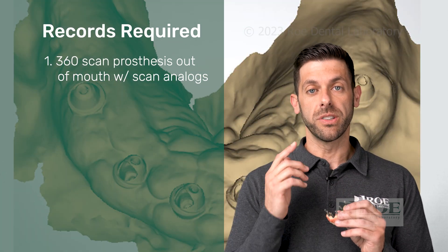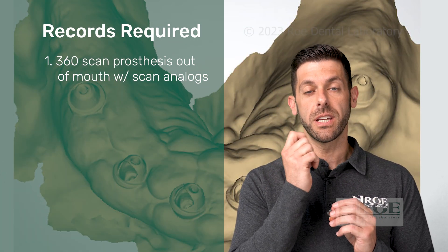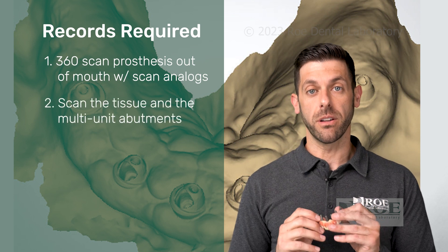Next, we want you to scan the tissue. We want to capture the tissue and the multi-unit abutments as well.